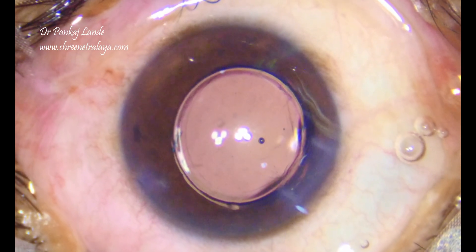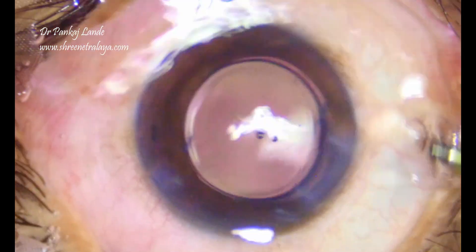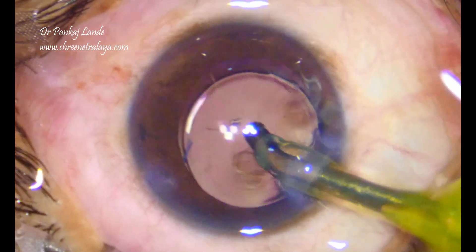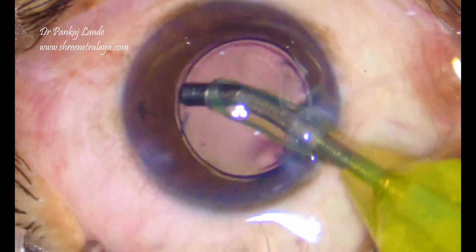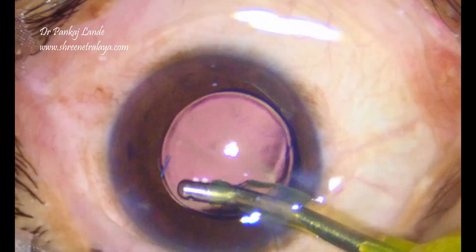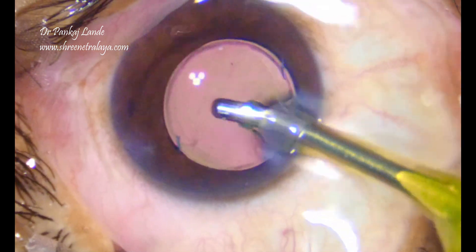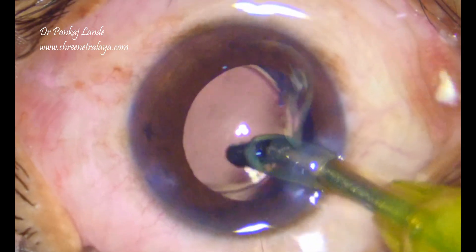I would not recommend using a smaller incision size for this type of surgery because that will unnecessarily tear the corneal wound and cause some astigmatism. Rather, if you extend the corneal wound to 3 mm you will be more comfortable, though it can also be injected through a 2.8 mm incision.